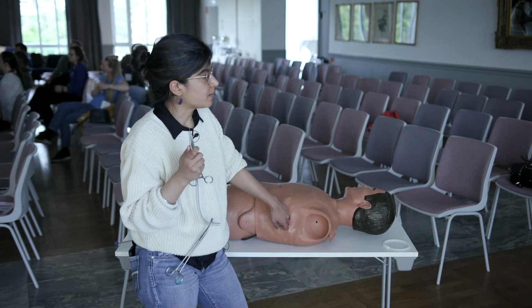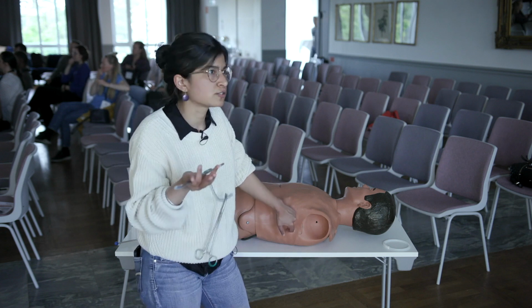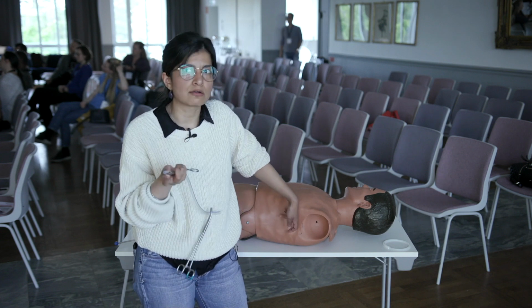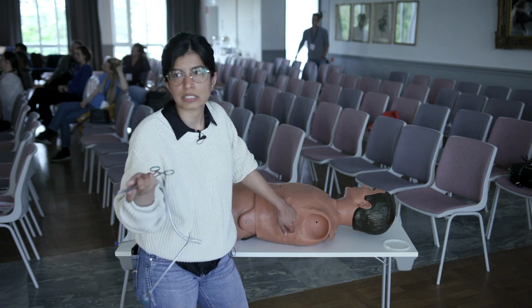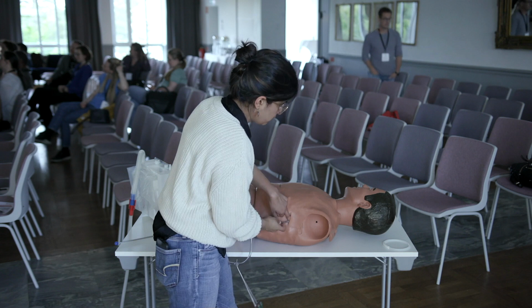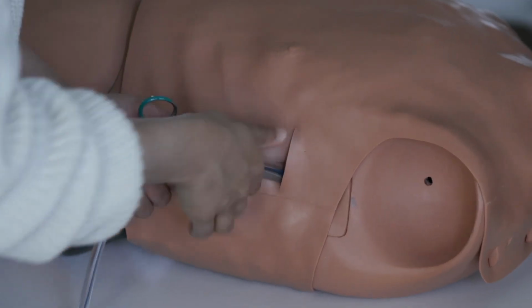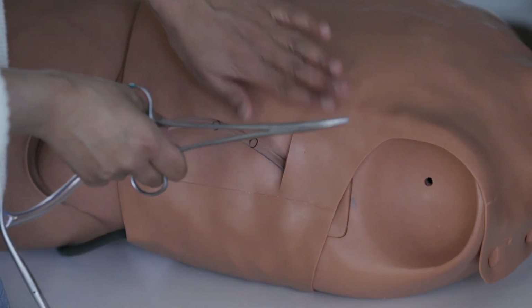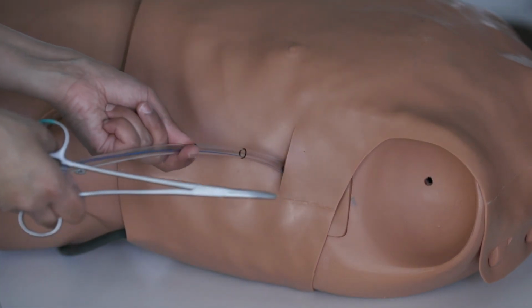And then if this is a retained hemothorax that's been sitting there for a few hours, few days, you can form blood clots, right? So you want to push those out of the way because they can very easily clog up your fenestrations, and then your chest drain becomes less effective. Okay, so you push this in. It's really actually hard to push the drain all the way in on him because he's rubber, but you want to push it past the markers.